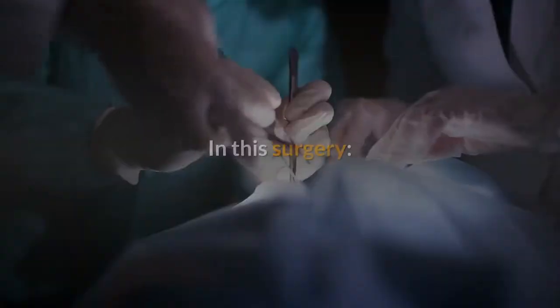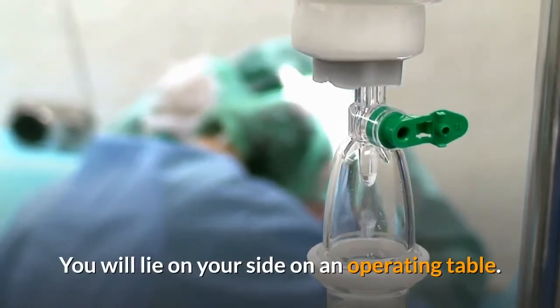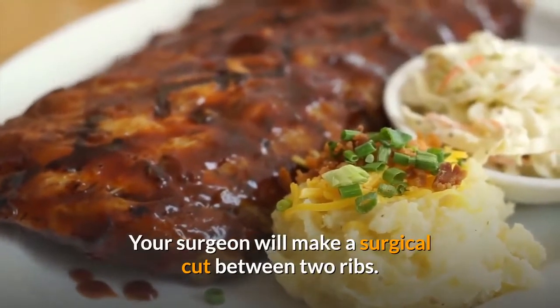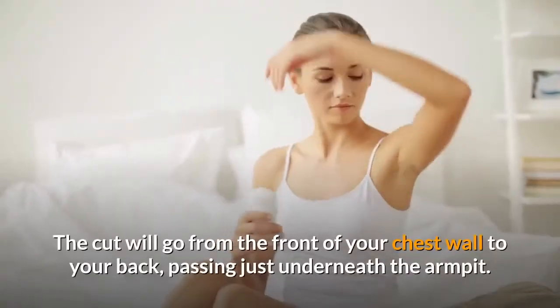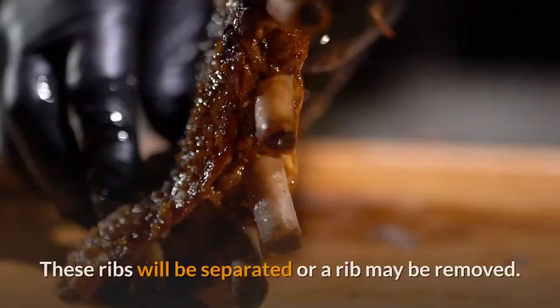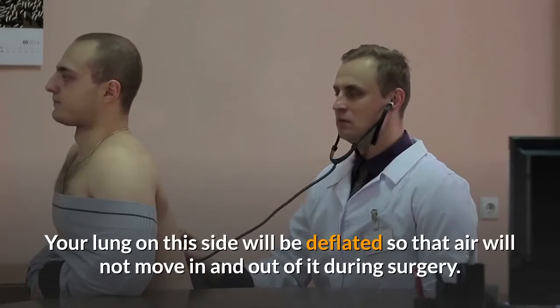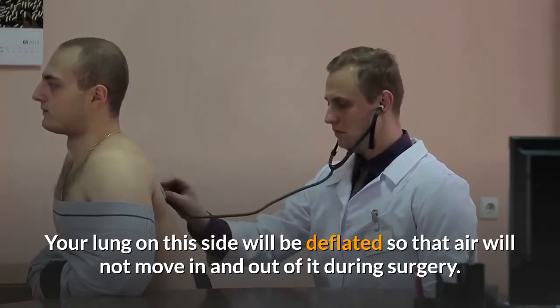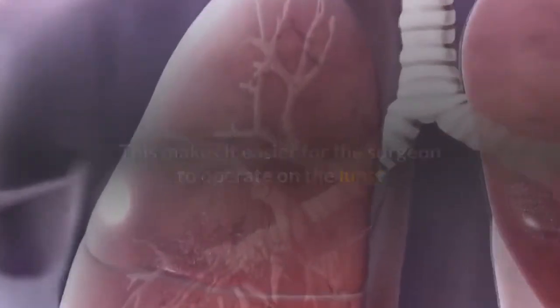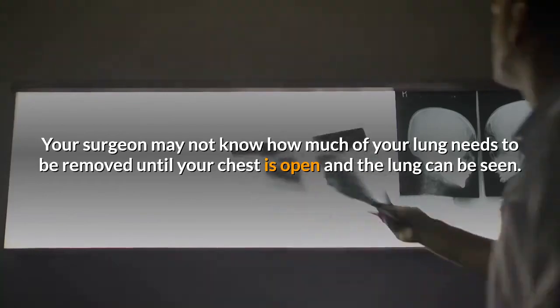Lung surgery using a thoracotomy is called open surgery. You will lie on your side on an operating table with your arm placed above your head. Your surgeon will make a surgical cut between two ribs, going from the front of your chest wall to your back, passing just underneath the armpit. These ribs will be separated or a rib may be removed. Your lung on this side will be deflated so that air will not move in and out during surgery, making it easier for the surgeon to operate.